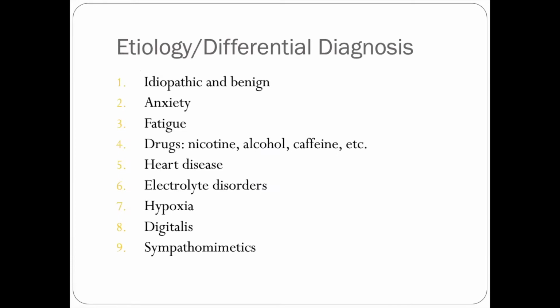And then there's all kinds of etiology for this that is the same as all the etiologies that we saw with the PACs as well.